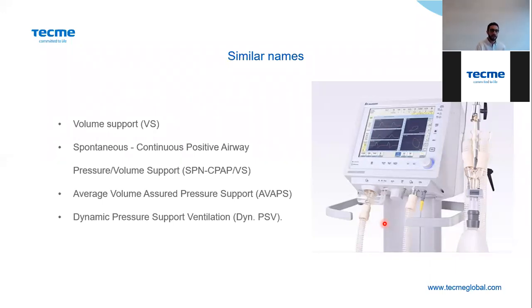Similar names: volume support, spontaneous continuous positive airway pressure volume support, average volume assured pressure support, dynamic pressure support ventilation, okay?